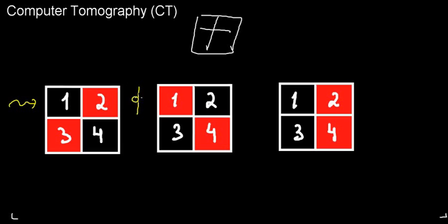And here on the other side, I would notice I detected an absorption of, let's just say, one absorbed square here. That means I have in this row, somewhere here, one dense square. I'm going to radiate this axis as well, so I'm going to get the same reading. So this means basically that after my reading, I know that somewhere along these lines, there is at each point one dense square.